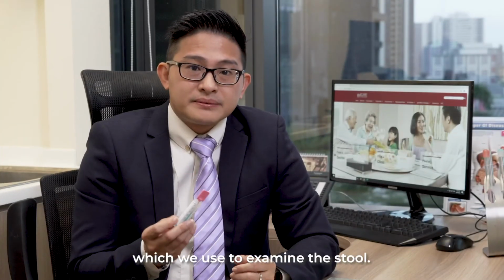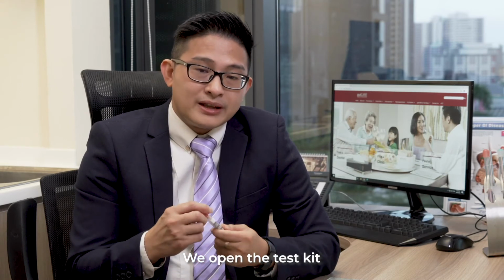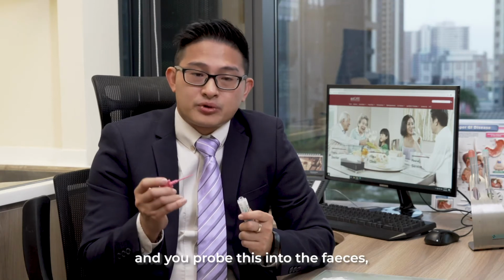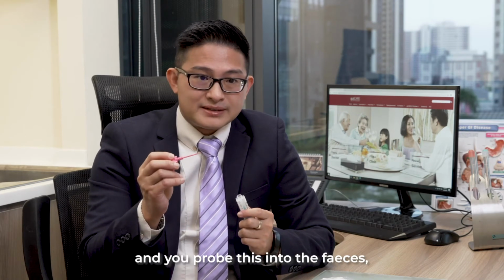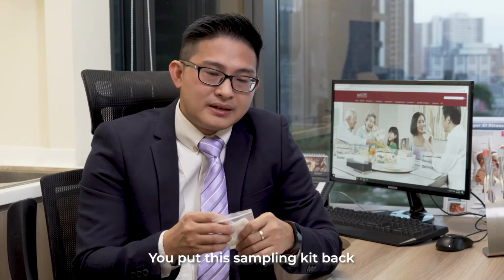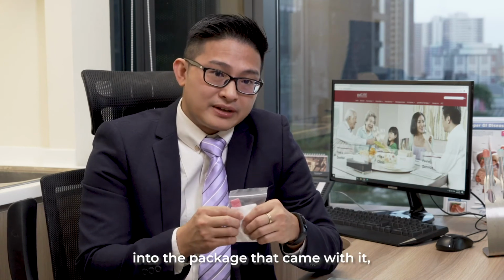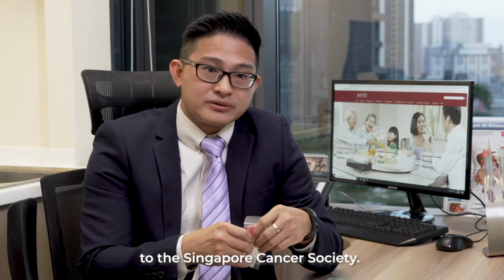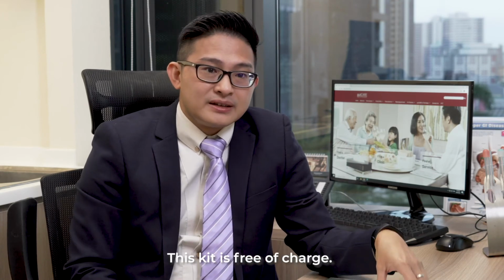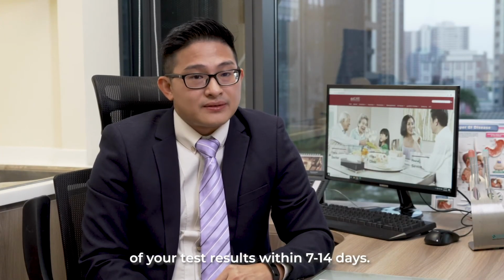This is the FIT kit that we use to examine the stool. So you open up the test kit and you probe the stick itself into the feces up to 6 or 7 times to obtain an adequate sample. And you put this sampling kit back into the package that came with it and you can post it back to the Singapore Cancer Society. And this kit is free of charge. The Cancer Society will inform you of the test result within 7 to 14 days.